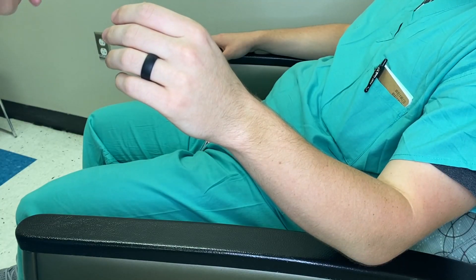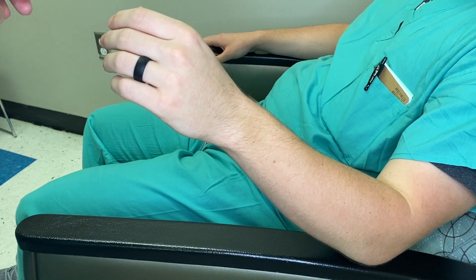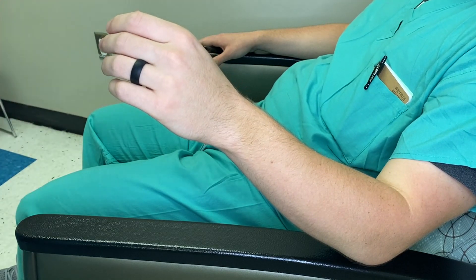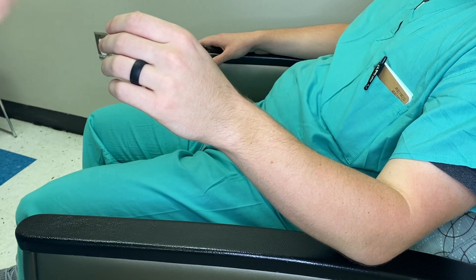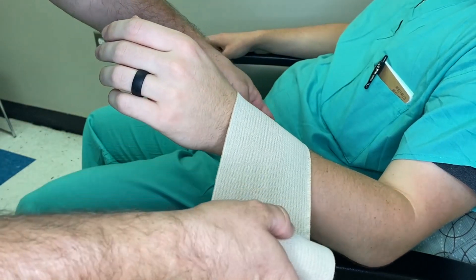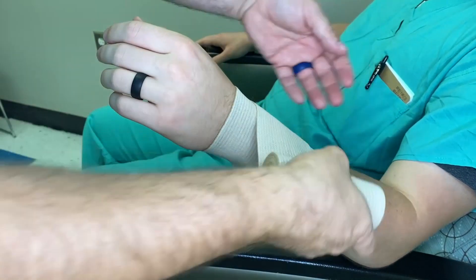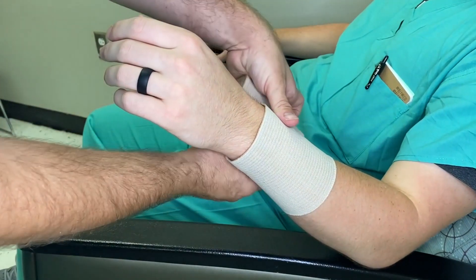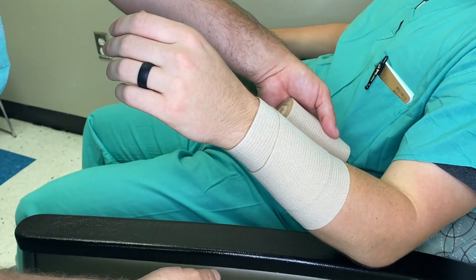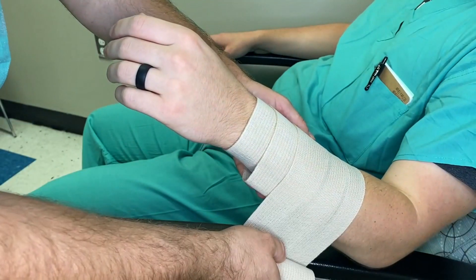If you're ever rolling curalex, cotton roll, web roll, fiberglass, or rolled plaster, you always want to let the material roll freely through your hand. People always ask about ace wrap tension. When rolling an ace wrap or coban, pull a little tension and then let it go freely around your hand — pull tension, roll freely. What you don't want to do is roll too loose because the material will just fall off the patient, or too tight because it'll be too constricting.